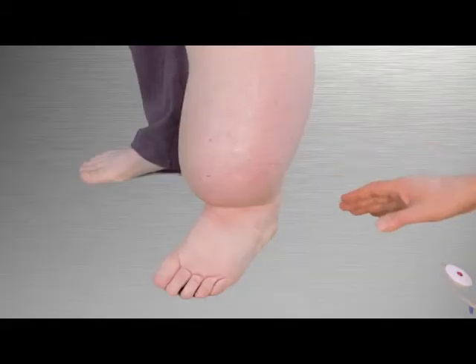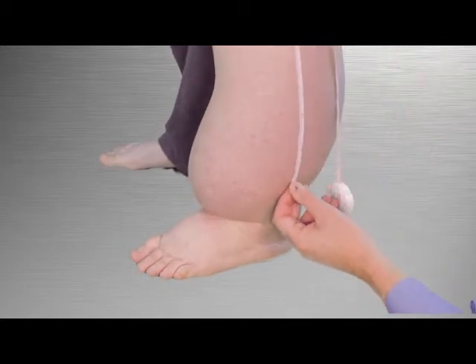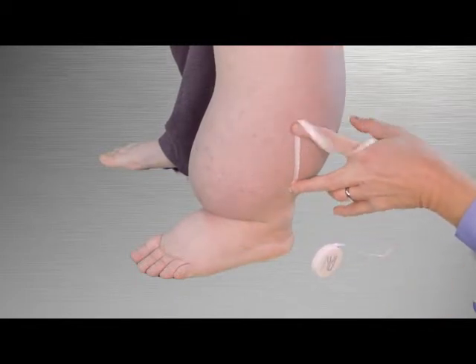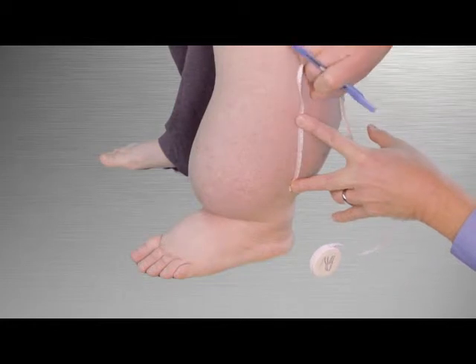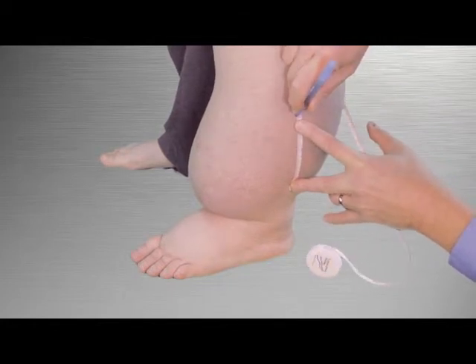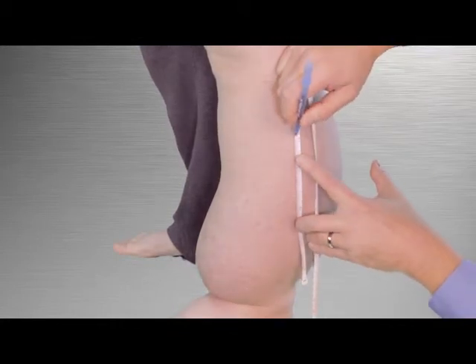Now that we have established the landmarks for the garment, we need to locate the circumference measurement positions on the lateral aspect of the leg, which is the outer side. Starting at the zero point on the lateral aspect, make a mark every five centimeters moving up the leg until you reach the bottom of patella.